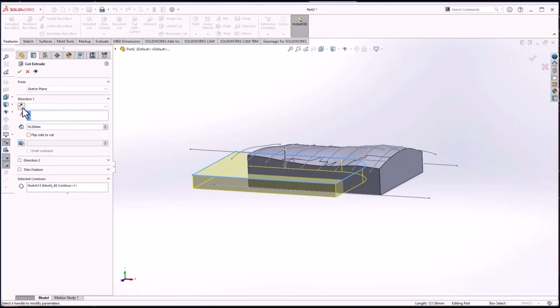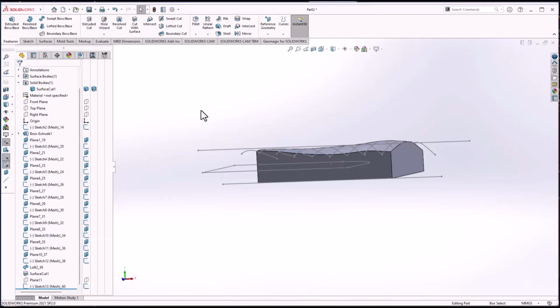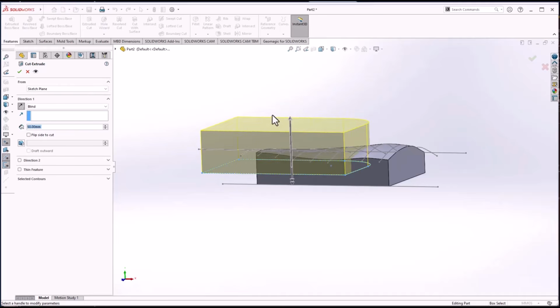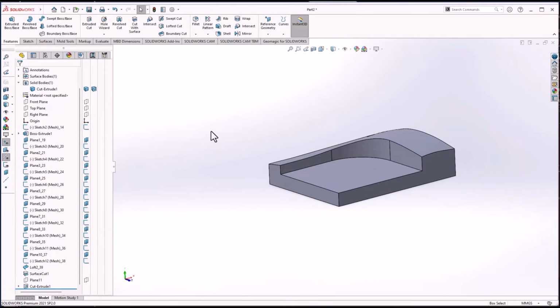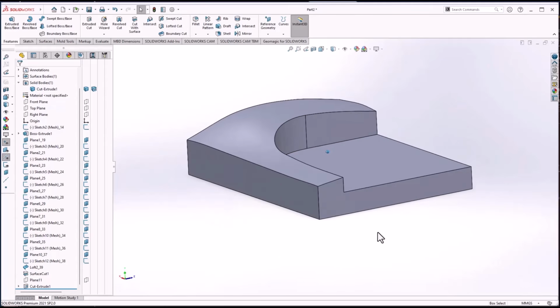And we will flip the direction. Let me just undo that. Let's just cancel out, undo. There we go. And do that one more time. Hit OK. So the idea again is if it's going to be a lot of steps to live transfer, a lot of things to fix during the live transfer, you may do this parallel modeling workflow where I model, or I extract and send and extract and send over to the CAD package to model. This is a valid workflow.